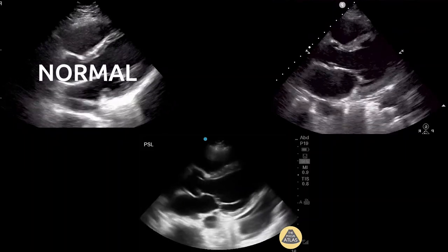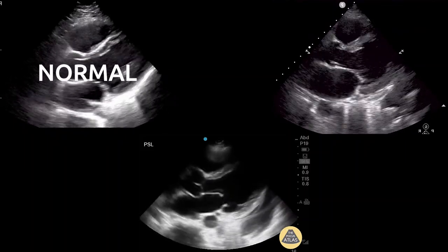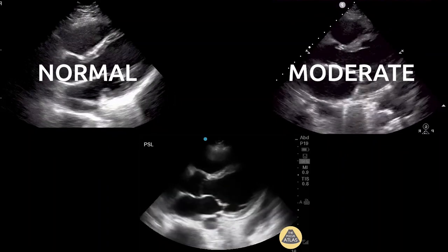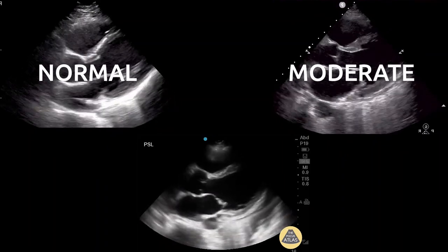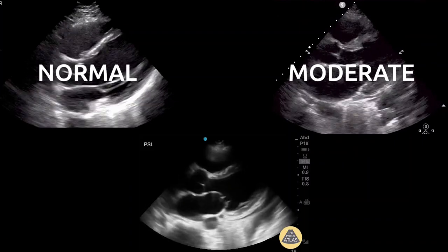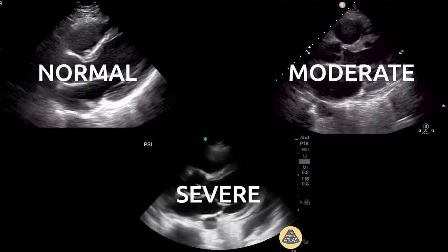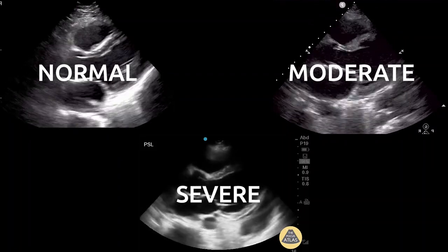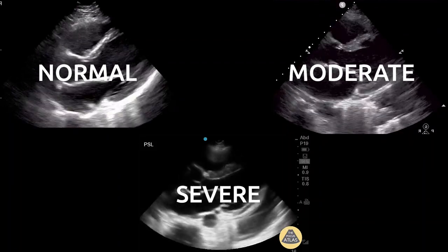Normal, which implies an LVEF of greater than 50%; moderately reduced systolic function, or moderate systolic dysfunction, which is typically considered to be an LVEF between 30 and 50%; and severely reduced systolic function, or severe systolic dysfunction, which typically implies an LVEF of less than 30%.